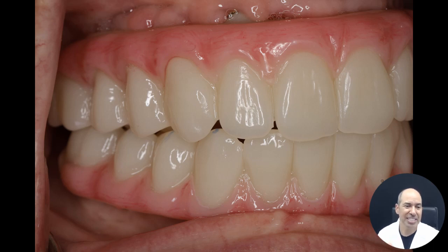The blue spots are checking the bite. How does it come together? And wow, look at that. So now we've got a provisional, a prototype that looks awesome, and I'm proud of it. So at this point, many months have gone by. Now I'm ready to go to the final.